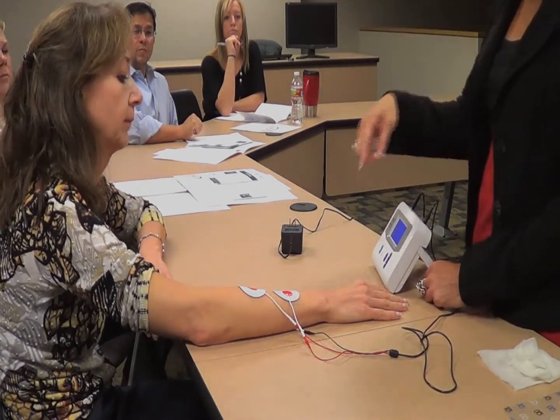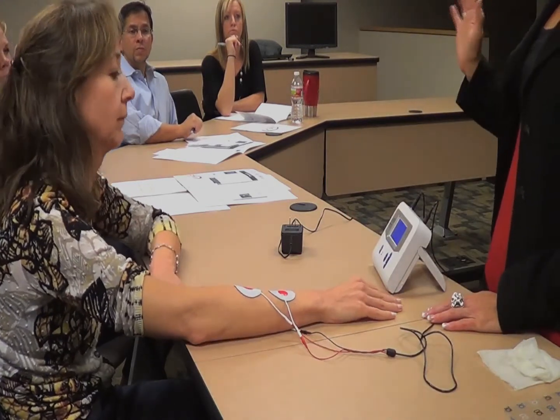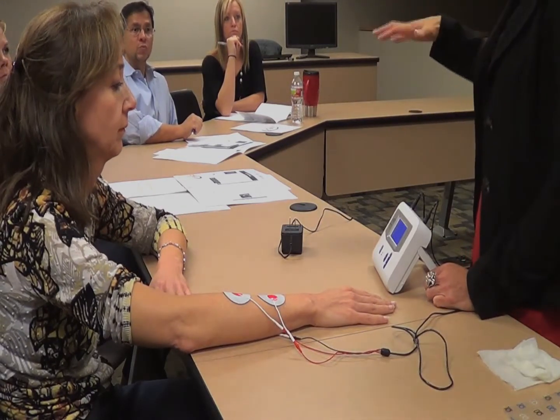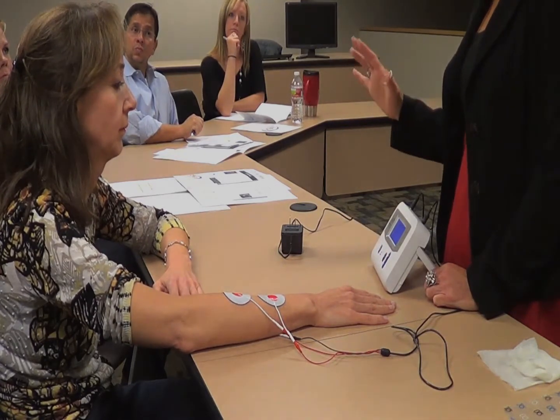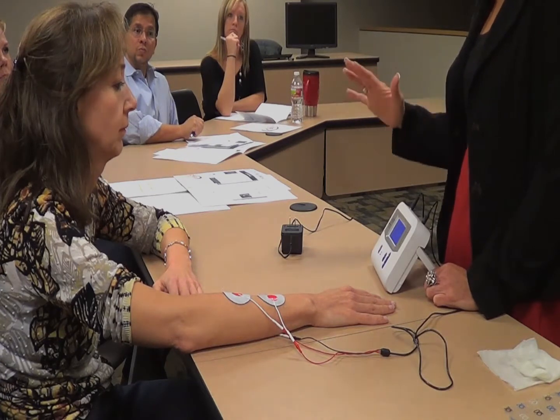That's the first thing you do after you put the electrodes on. So it starts out at 0, you're going to want this to be at 12 milliamps or above. There isn't really an average of what a patient is. It just depends on what you can get a good contraction out of them. If it's just a little bit and you're not causing them any pain and they don't really want you to do it, at least you've got some and you can build from there.